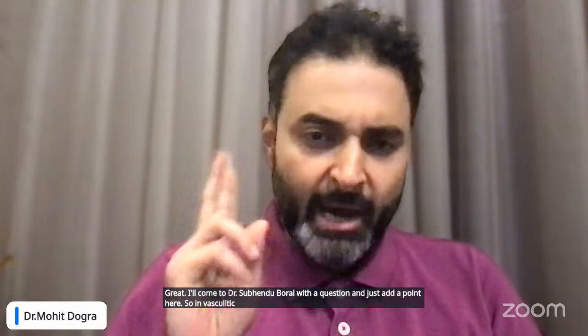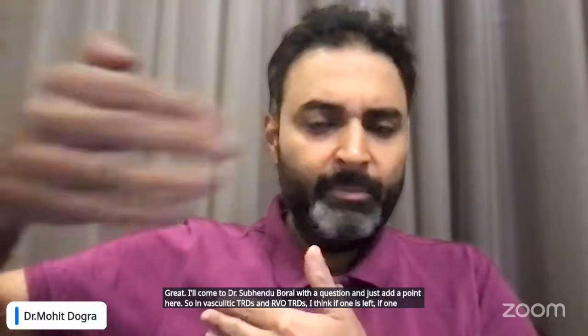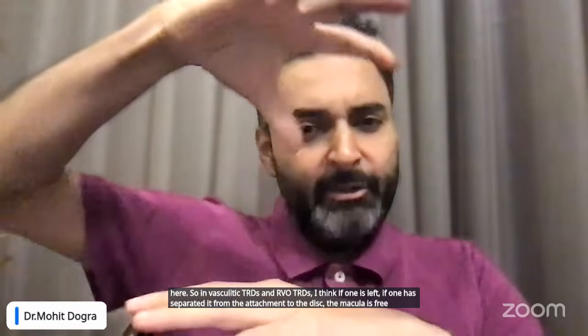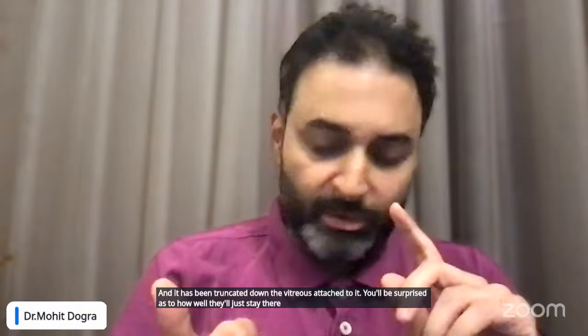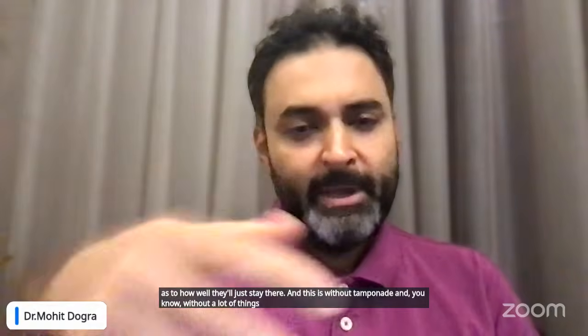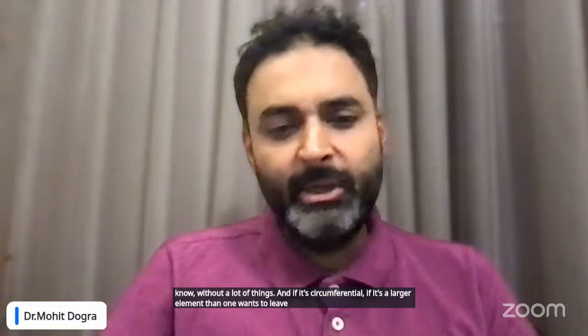Wait, I'll come to Dr. Subhendu Boral with a question, and just add a point here. In vasculitic TRDs and RVO TRDs, if one has separated it from the attachment to the disc, the macula is free, and it has been truncated down with the vitreous attached to it, you'll be surprised how well they just stay there. And this is without tamponade and without a lot of things. And if it's circumferential, if it's a larger element that one wants to leave, then absolutely, as Mahesh sir said, I think encirclage with the broader tire makes sense.